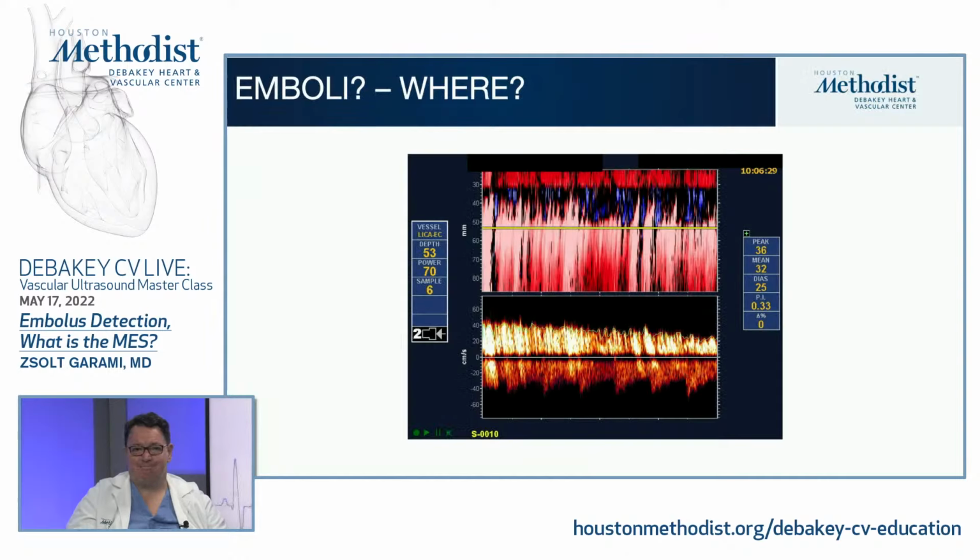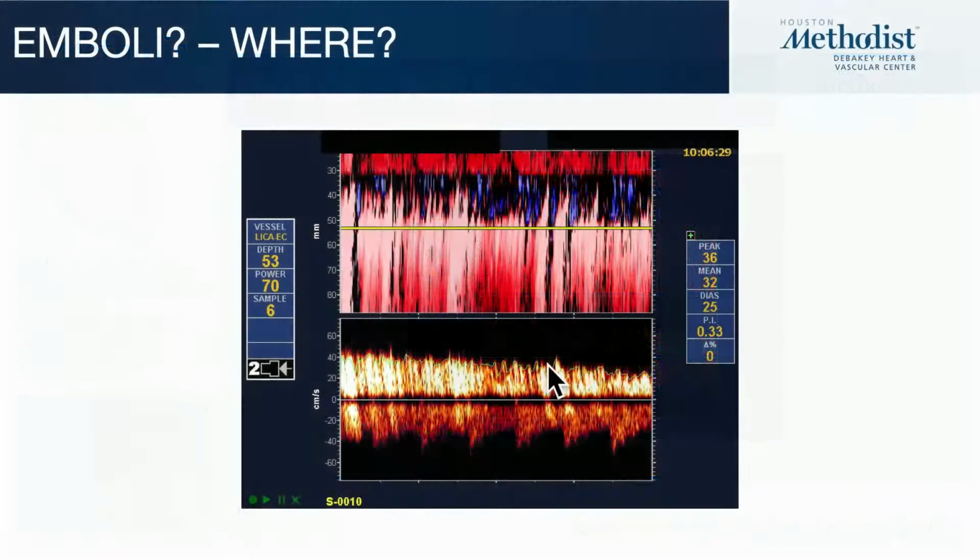And again, this is in the ICU, left ICA, and this is your submandibular ICA, and this is your IJ. Sometimes when you do subarachnoid hemorrhage monitoring, a nurse injects some medication. Get ready, as some venous embolus signals will appear.